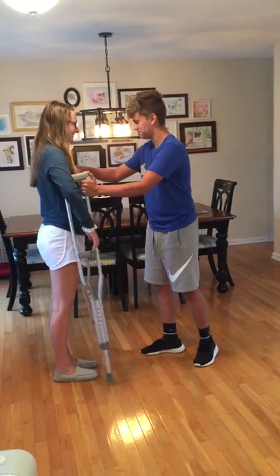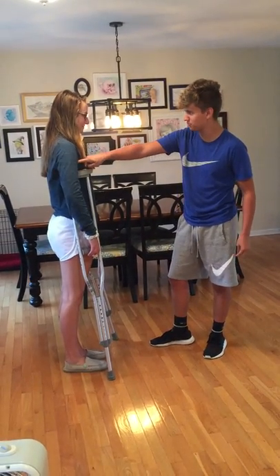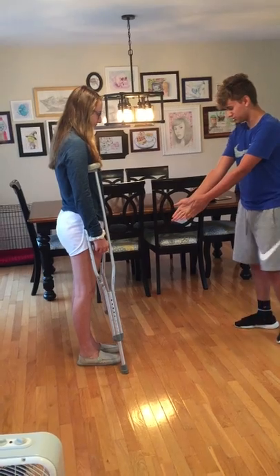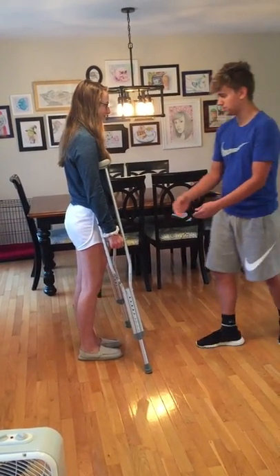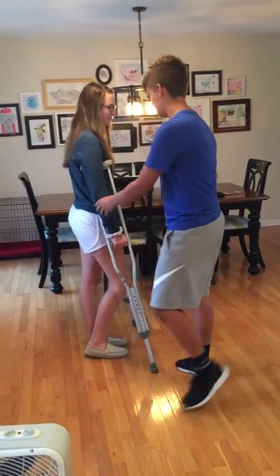You want to make sure to keep an inch in between this part of the crutch and your armpit. Put the crutches in front of your feet by 2 inches and out 6. And make sure to keep your elbows locked at a 30 degree angle.